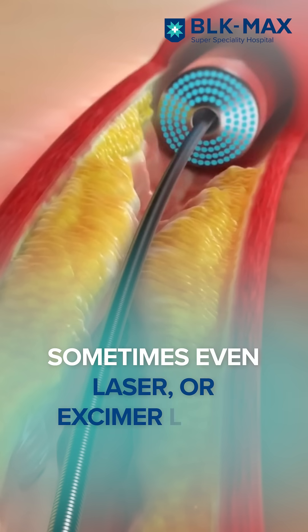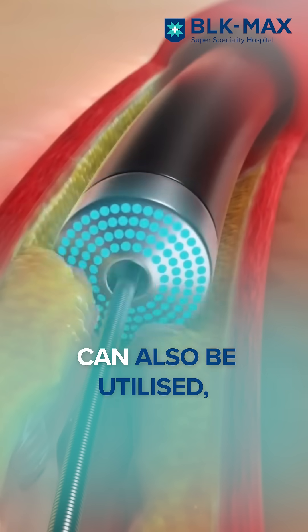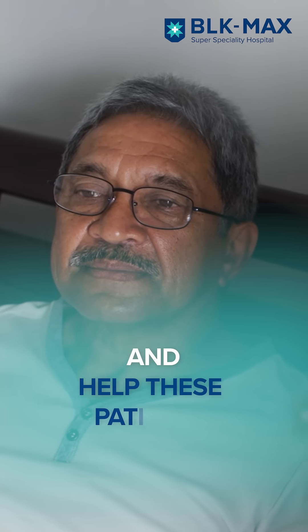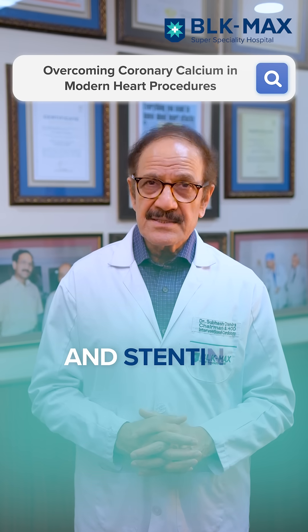Sometimes even laser, or excimer laser, used in the coronary artery, can also be utilized to break this calcium, helping patients who are surgically refused and making angioplasty and stenting successful.